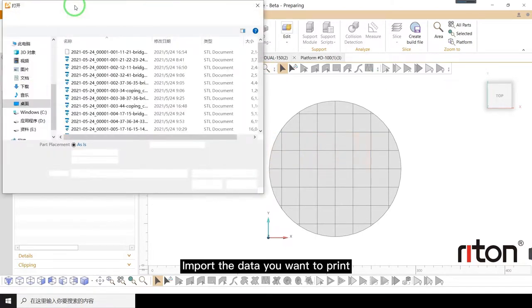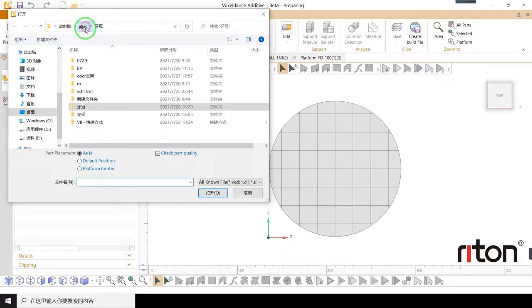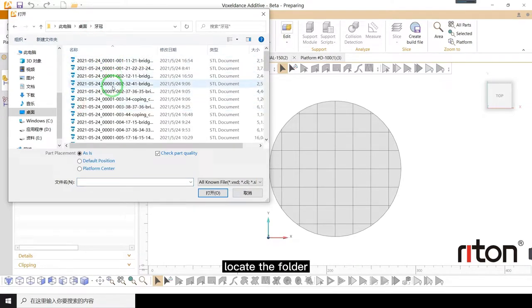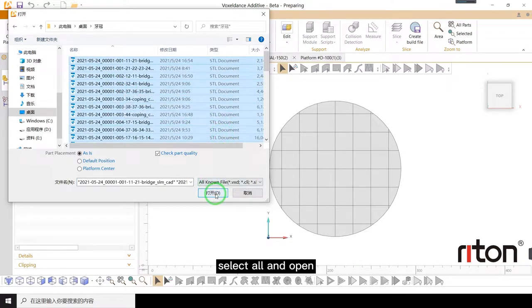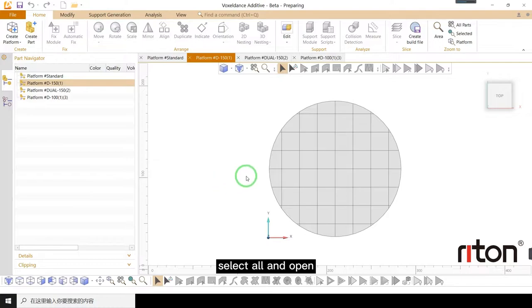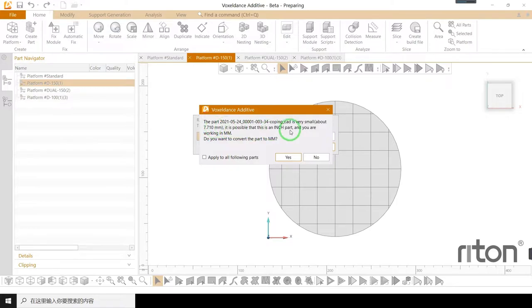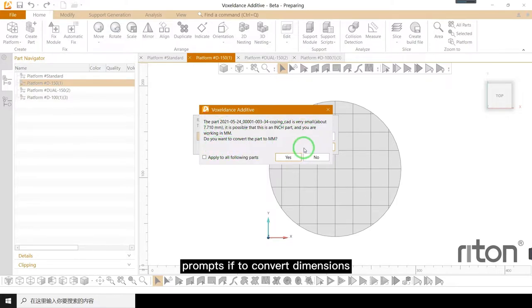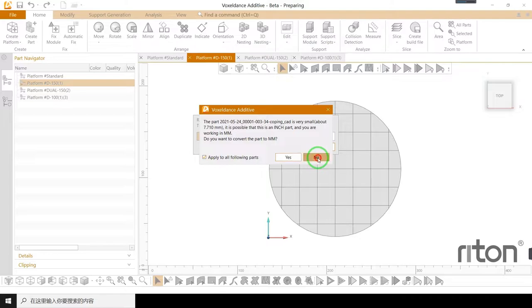Import the data you want to print. Locate the folder, select all and open. Prompts if to convert dimensions. Apply to all and click no.